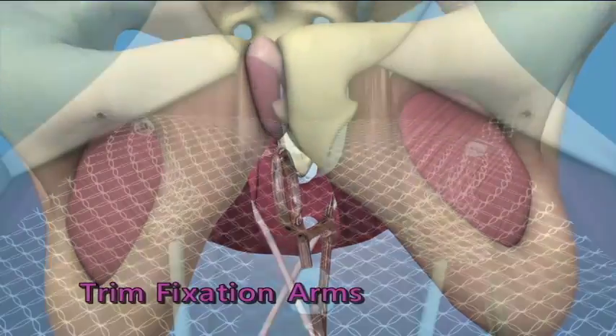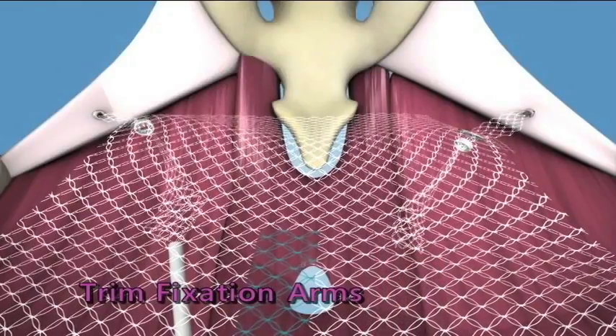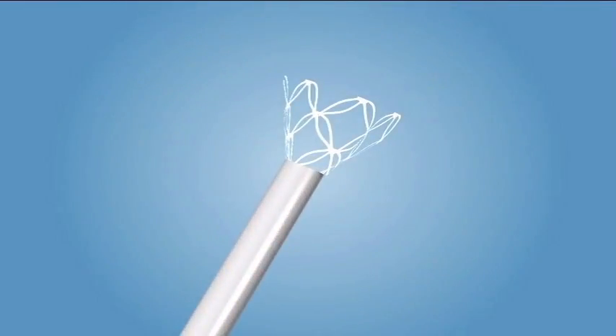Trim the Fixation Arms. Trim the fixation arms so that at least 1 centimeter of mesh extends past the locking eyelet, and verify the end of the discarded fixation arm contains mesh.